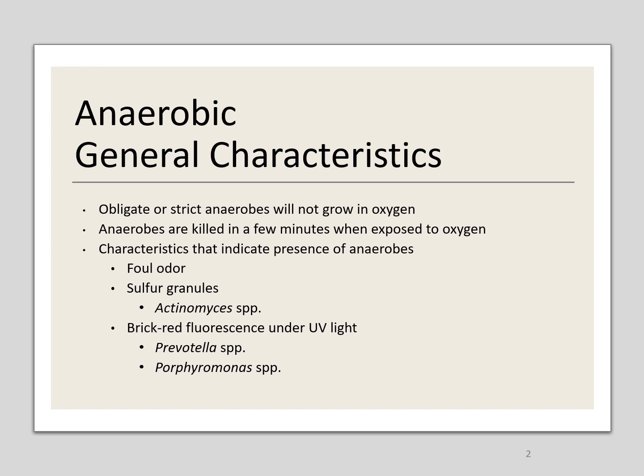Anaerobes are killed within a few minutes if they're presented to oxygen, so the collection technique is very important if you're suspecting an anaerobe. So these cultures may be collected through some sort of syringe or aspiration, and if it's something like a swab, then it would be placed in a special media that would prevent exposure to oxygen for that organism.